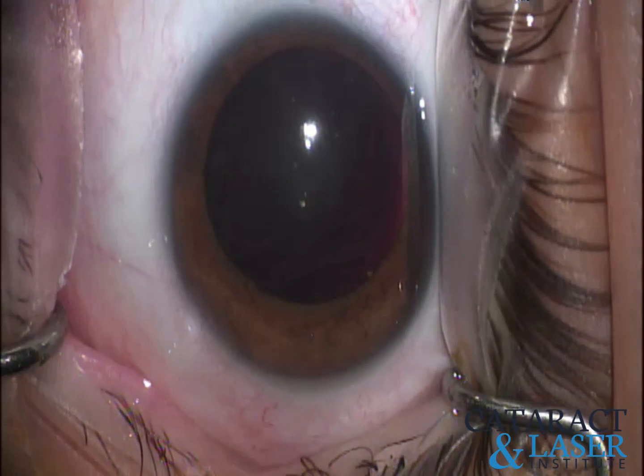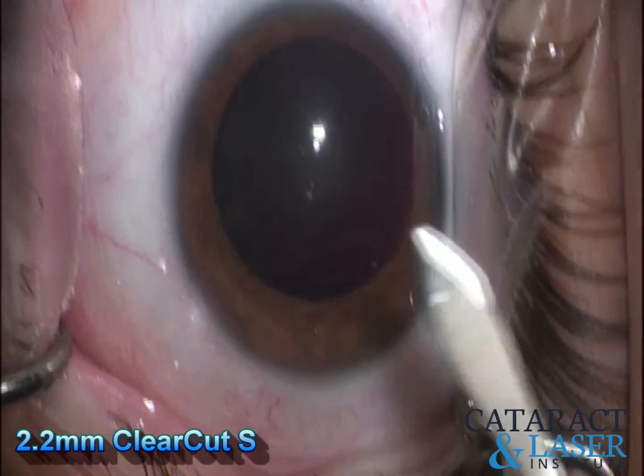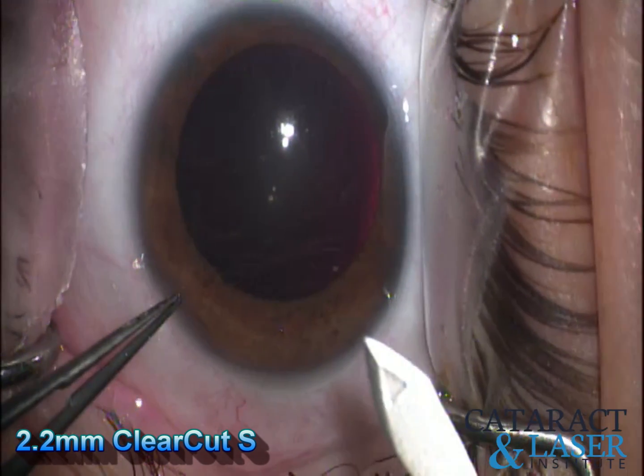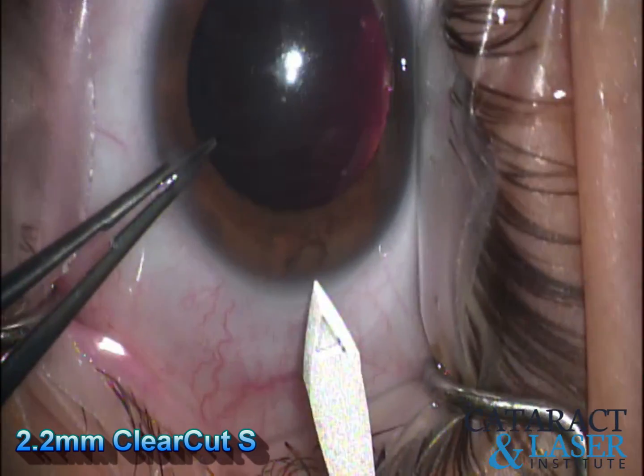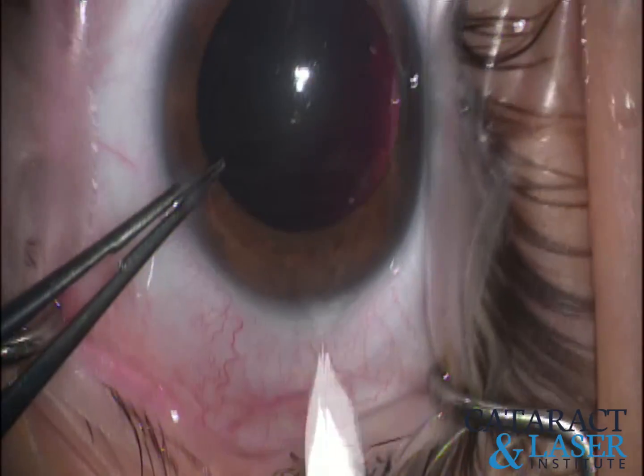For my primary incision, I do a 2.2mm ClearCut S from Alcon. I like to feel the metallic blade over the diamond blade for my primary incision. I do a pseudo-two-step incision — a relatively flat incision.